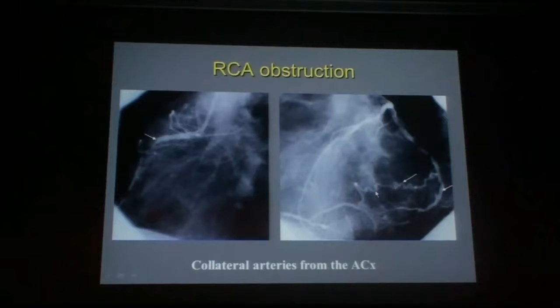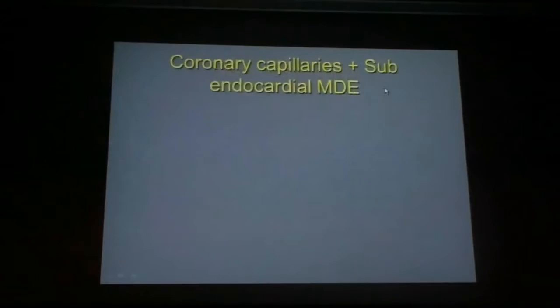And if you make a perfusion imaging of your heart, you're going to believe that everything is okay, but in fact it's not, and you do have an occlusion of the right coronary artery that you're not going to be able to see. So there is complementary information coming from the perfusion imaging we have with MRI and from these anatomical images that we can get from CT or from fluoroscopy.